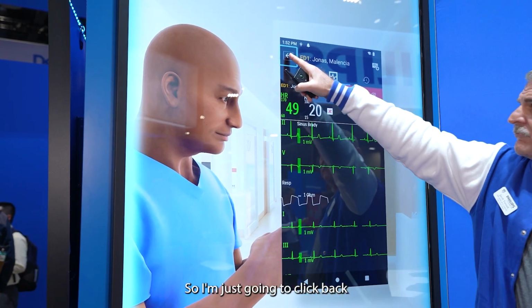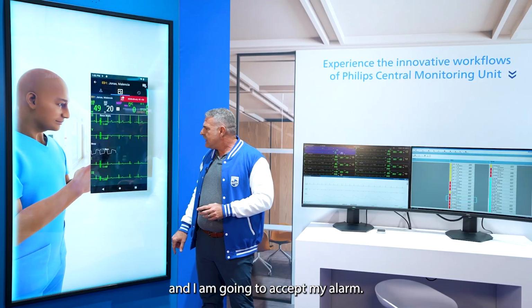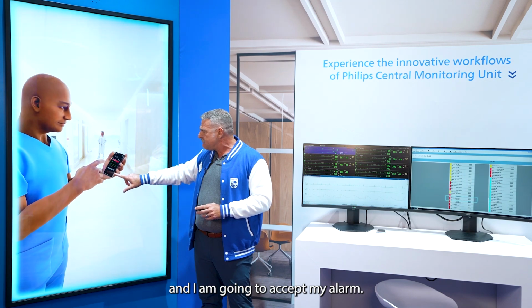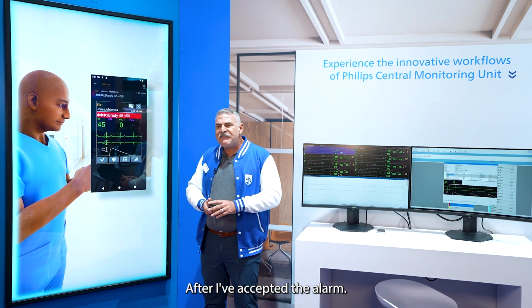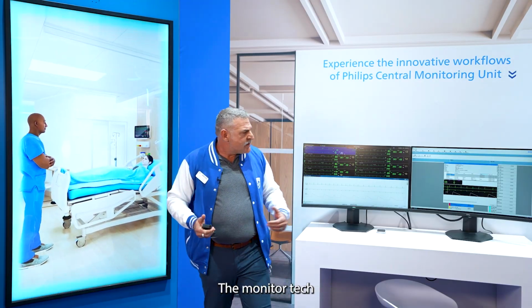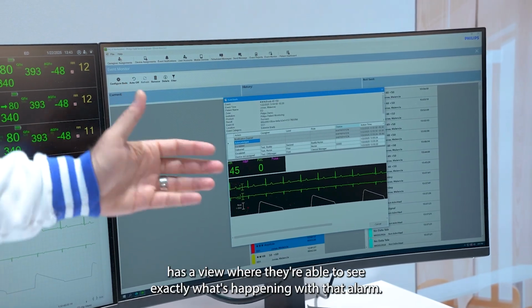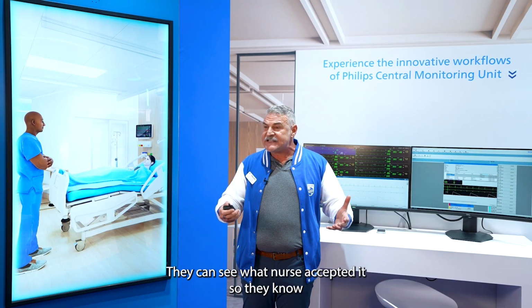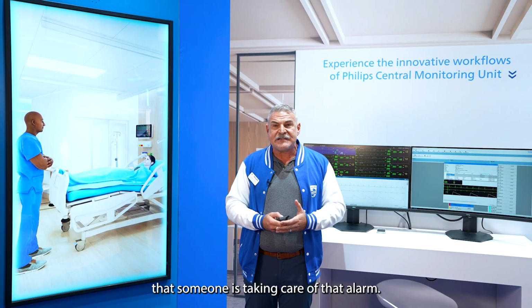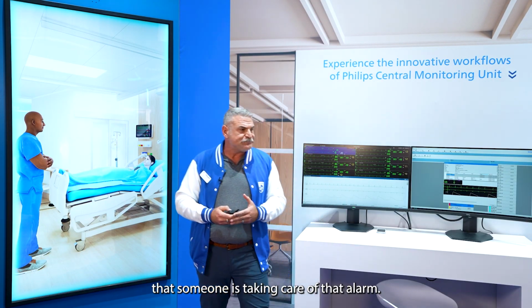So I'm just going to click back and I am going to accept my alarm. After I've accepted the alarm, the monitor tech has a view where they're able to see exactly what's happening with that alarm. They can see what nurse accepted it, so they know that someone is taking care of that alarm.